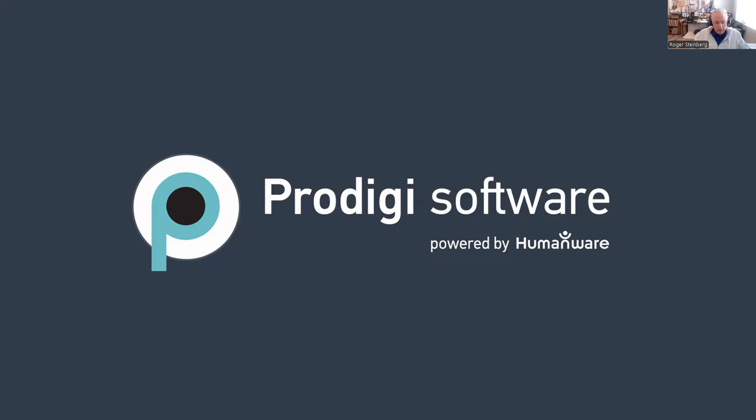And then I will plan next month, because there isn't a release in the month of May, to do a more in-depth demonstration of the software. But for today's purposes, I'm going to be more or less focused on the features that will be coming out next week. So with that having been said, I'm going to go ahead and get started here.